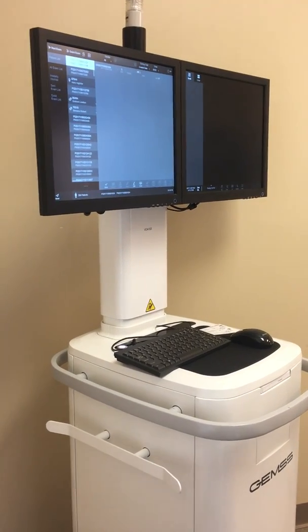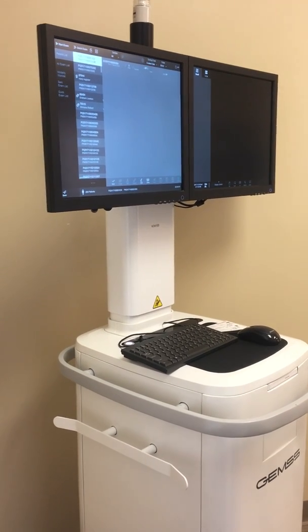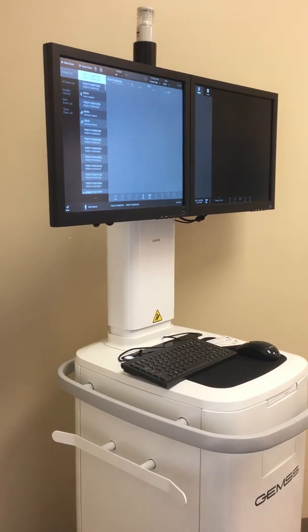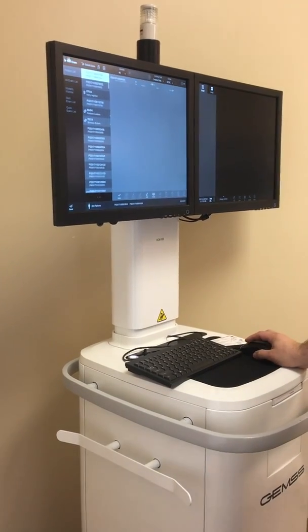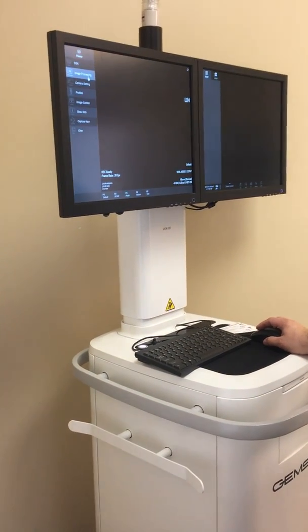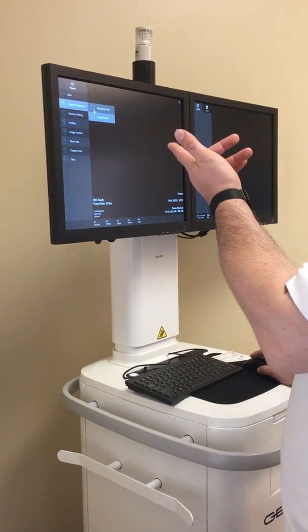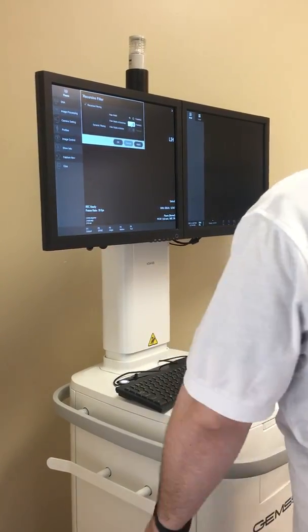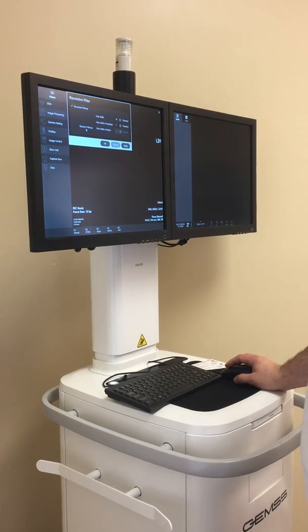Honestly, unless you go in and start making all kinds of weird image quality changes, it does. In which case, if you do, you just call me. I'm a huge reset button pusher. But here's the thing, you can push buttons. You could come into the image processing and change things. As long as you don't start typing numbers in, it really doesn't matter.